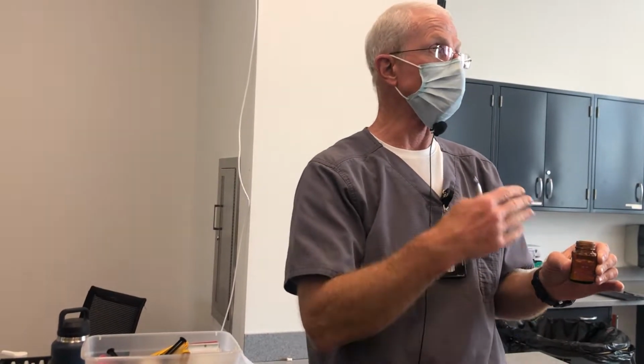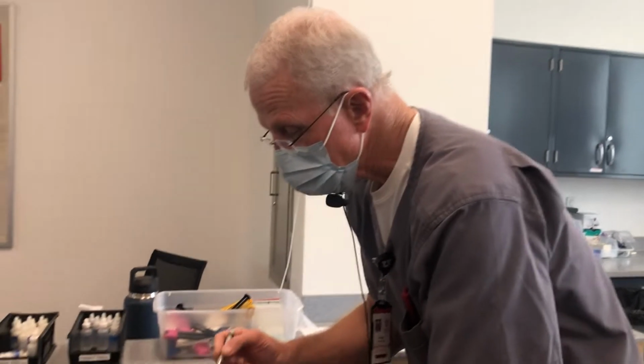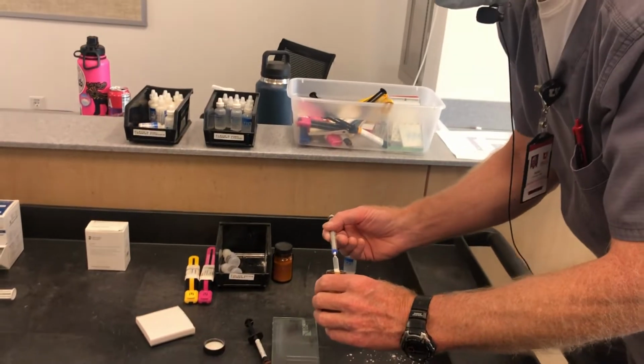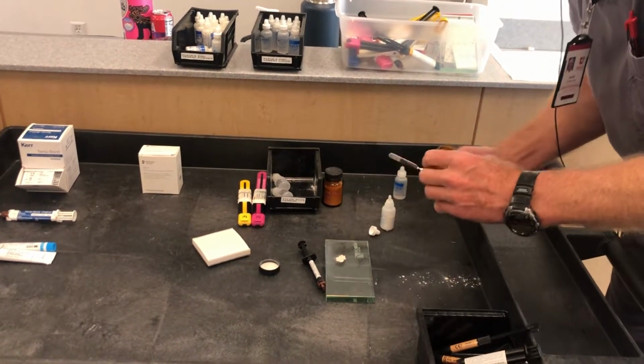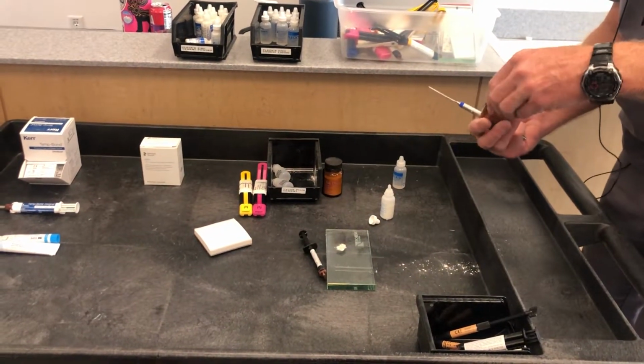One of the things we found with this was used a lot in the 70s and 80s, but about 10 years in, these crowns would come off because the cement would dissolve. And so we realized this is not a good long-term cement, again, because of solubility. It's just much more soluble than the resin-based cements. But this is a nice cement for holding on a temporary, maybe, that doesn't have much resistance and retention form.